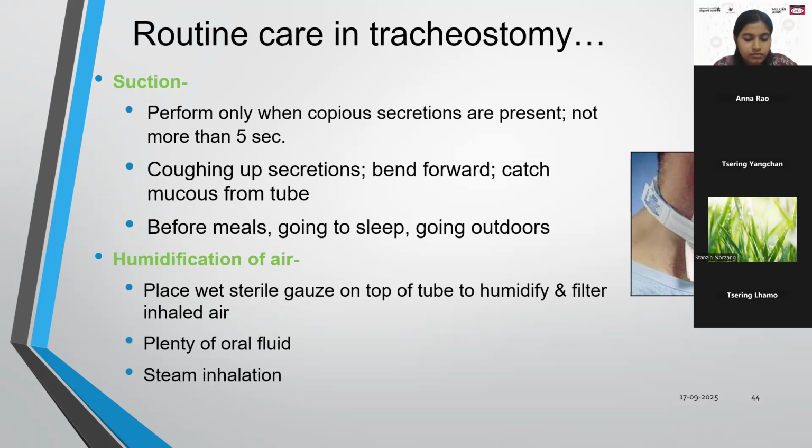What about the tie? Many times you find it has become very dirty, the color has totally changed. So ask the patient to change the tie also. You can ask them to apply a dark color tie also, so it will become less dirty, but it should be changed. That should be noted. And for that they have to use the mirror.